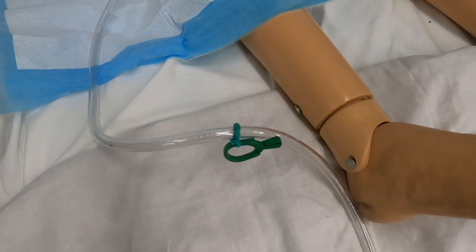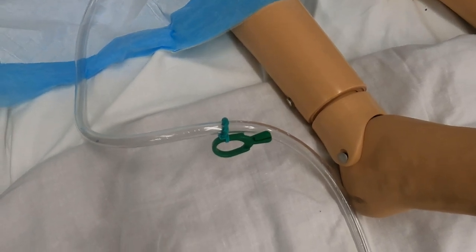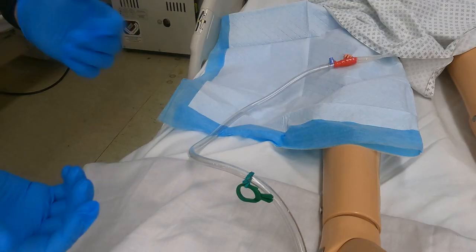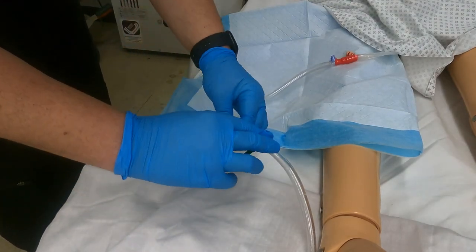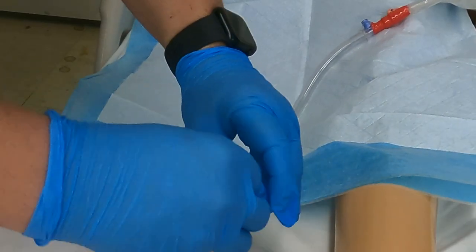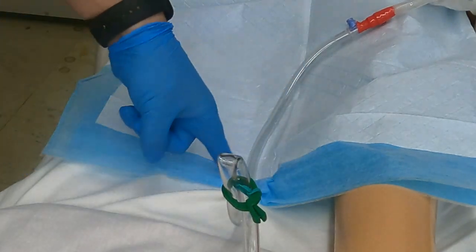As you can see, this port is a luer lock, meaning that you can take a syringe and screw it onto it, and it's going to allow you to withdraw. Before you withdraw any urine to collect the UA, you need to clamp the tubing. This particular Foley catheter has a green clamp. So with your gloves on and after performing hand hygiene, you're going to bend the tubing and clamp it right over the top, and then the urine is going to collect right in there.